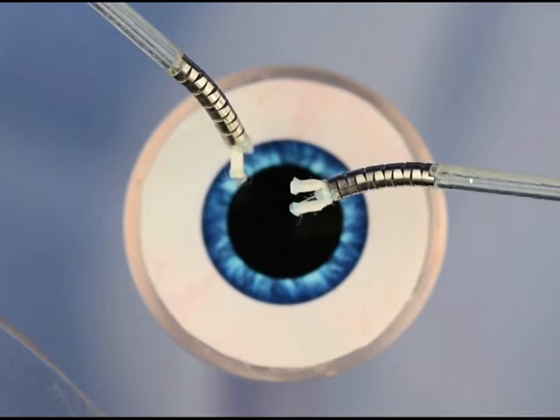So I think what we're trying to do is take a big step down in terms of the robot size and then see how far we can get in terms of performance using this flexible actuator type system.